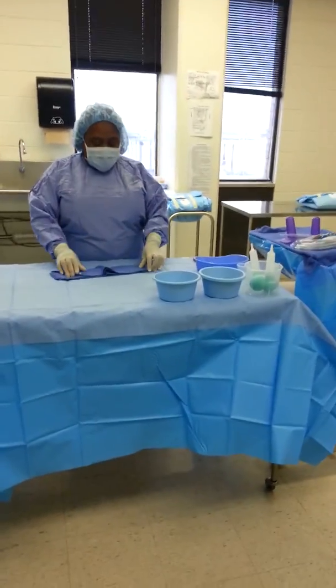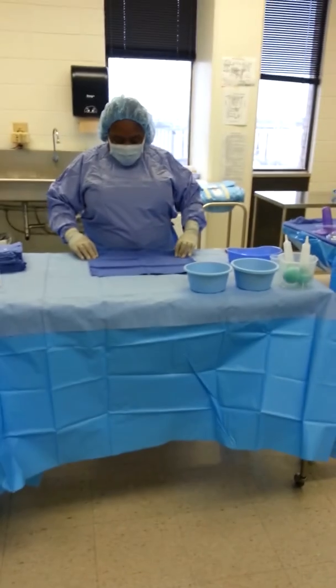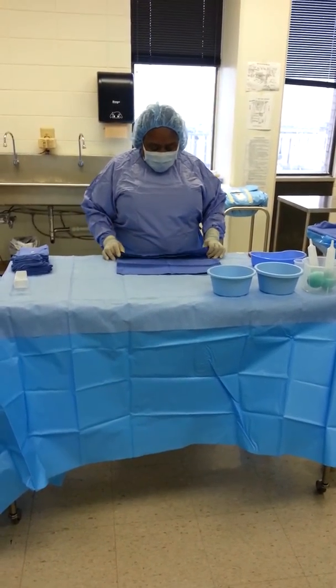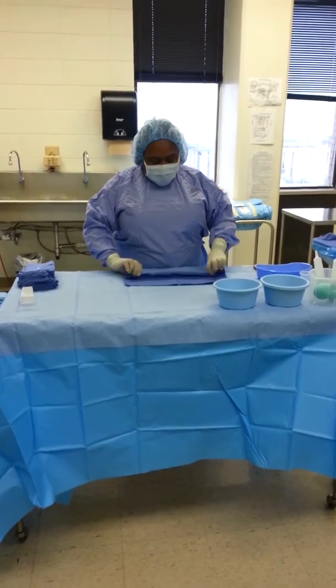Next thing you have to do is make roll towels. This is the roll towels for that basic set of instruments, the long instruments Ms. Christopher taught y'all. All I do is take the towel and fold it in. I don't tuck the corners or do all that. I just fold it. I want it thick and firm.